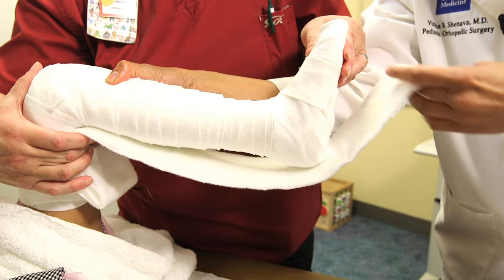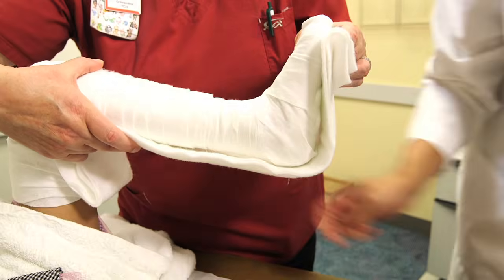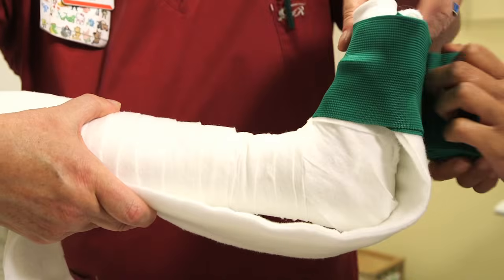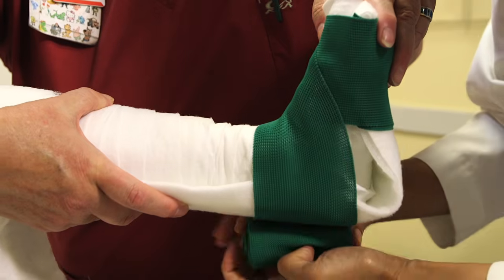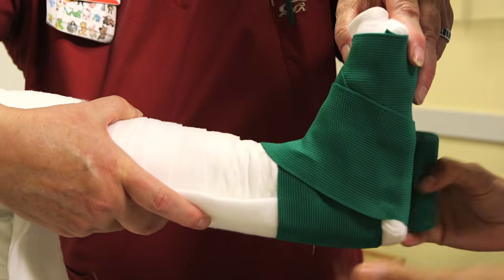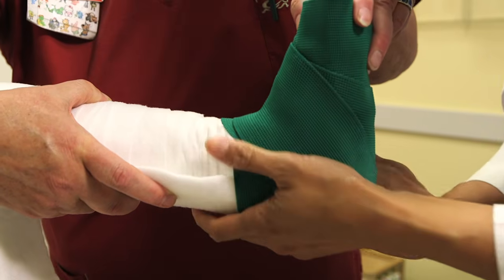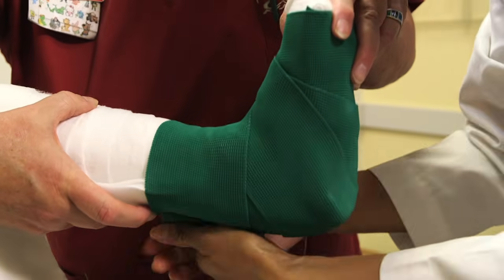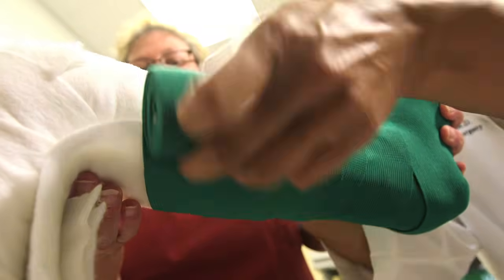And then we're going to lay it on the back of the leg and then wrap that up with our ace wraps. You want to, again, wrap smooth with gentle pressure. You don't want them too tight. This allows the patient to be comfortable with their injury, but also gives them the ability to swell in that acute injury phase.